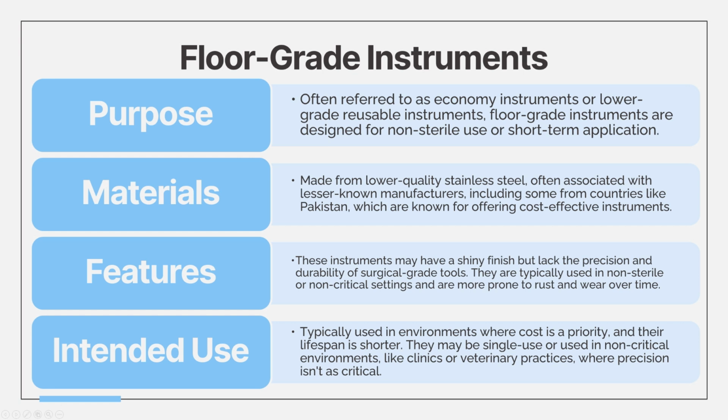Now we're going to talk about floor grade instruments. So the economy instruments, that's what we refer to them as. They are economy instruments for non-sterile or short-term use. So imagine they are used in labor and delivery, emergency department, radiology, for example, where a sterile field is not exactly critical to the patient's health.